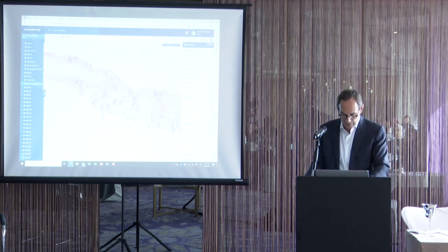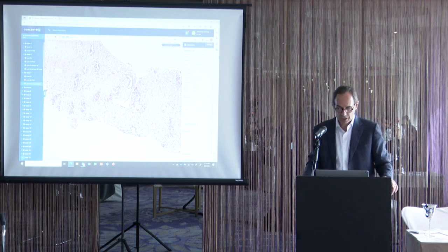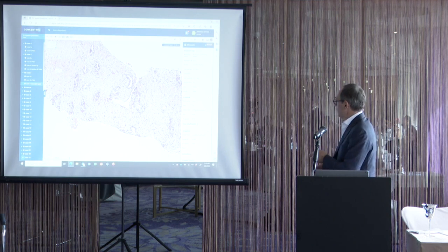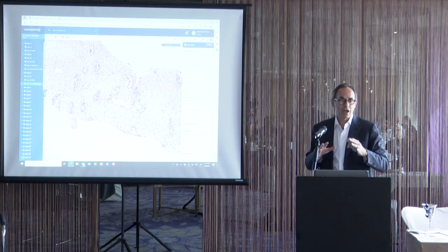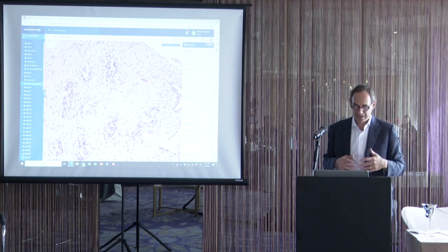In contrast, benign prostate tissue with radiation change, paradoxically, the cells look much worse than cancer. So the key thing with benign prostate tissue with radiation change is that at low power, the glands are still architecturally, spatially separated from each other in a normal distribution. So if you look here, you can see this kind of gland stroma, gland stroma, gland stroma. They're all spaced apart, not crowded, not irregular. So it's a normal architectural pattern.